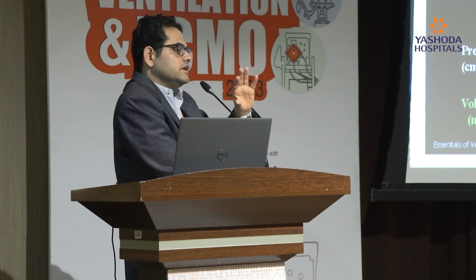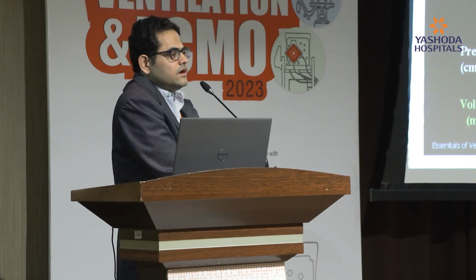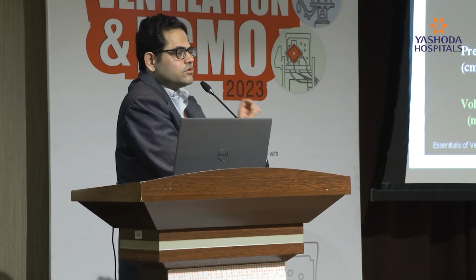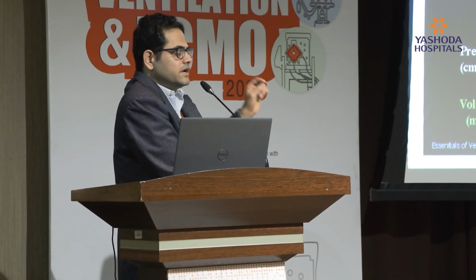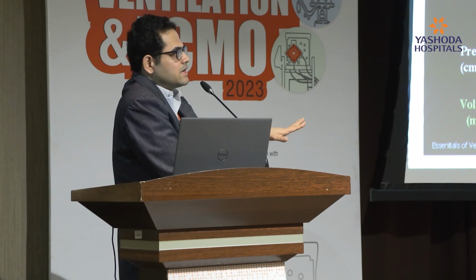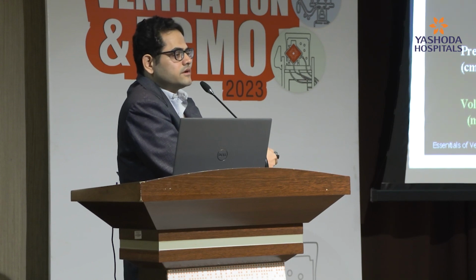Nowadays the concept of control mode is decreasing. Whenever the patient is not taking any spontaneous breath or the patient is paralyzed, then the ventilator will be acting as a controlled mechanical ventilator. But nowadays all patient ventilators have assist control. Any breath triggered by the patient will be completely supported by the ventilator with its parameters. Either you keep it as volume targeted assisted, or you can keep it as pressure targeted assisted.